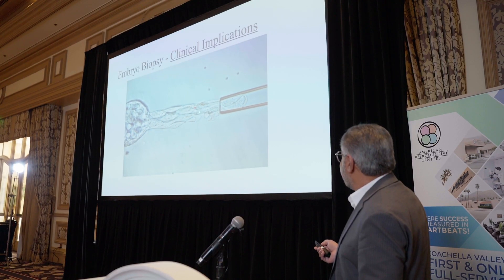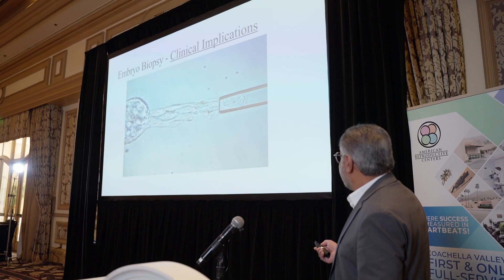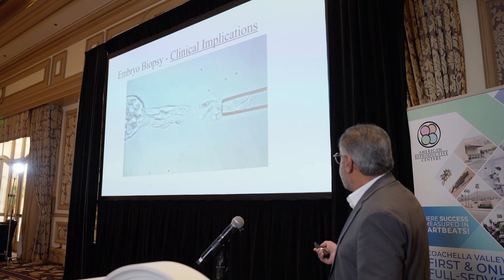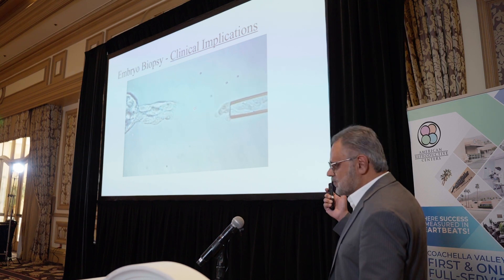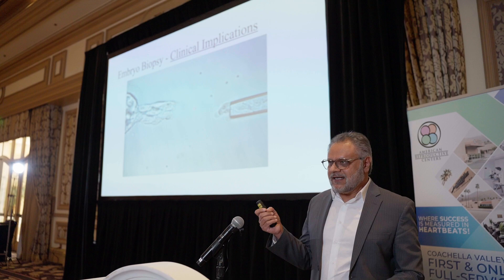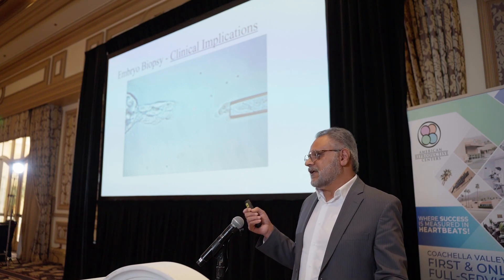The cells are pulled with one more laser shot, and this is how we get four to five cells and send them out for genetic testing. This is how we determine whether the chromosomes of the embryo are normal or not, and also whether there is any single gene defect.